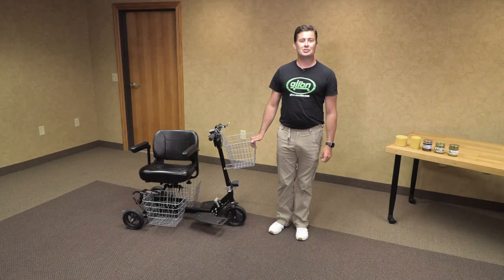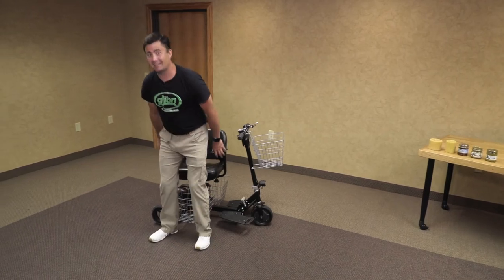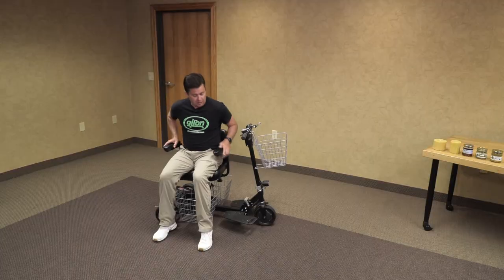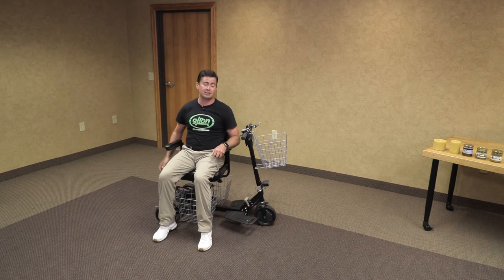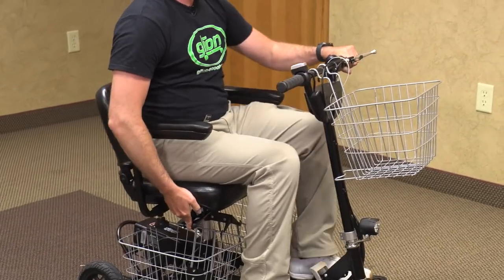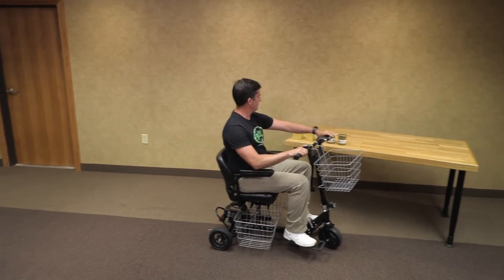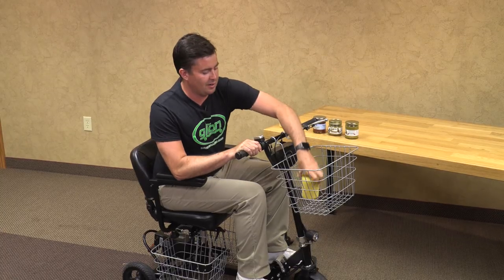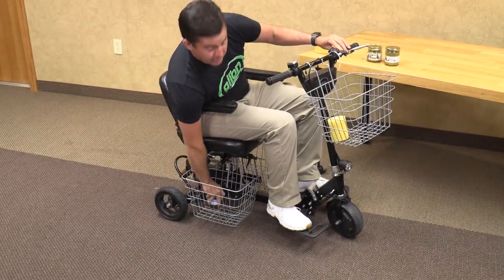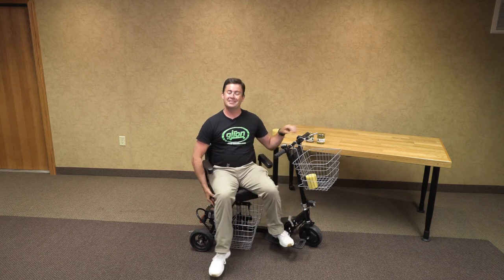Now I am going to show you the function of the shopping cart for your Glyon Snap and Go. We recommend getting into it with the seat to the side, as you can use the armrest to assist yourself. Do not use the pads to try and get into it as there is a chance you might tip it over. When loading your shopping cart, make sure you keep a good center of balance and don't lean too far one way or the other as you could potentially tip it over.